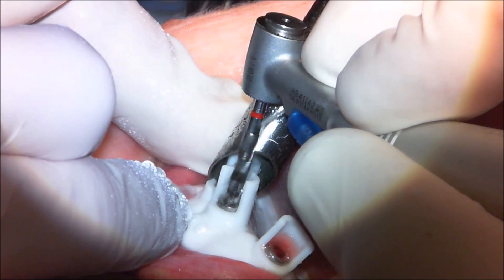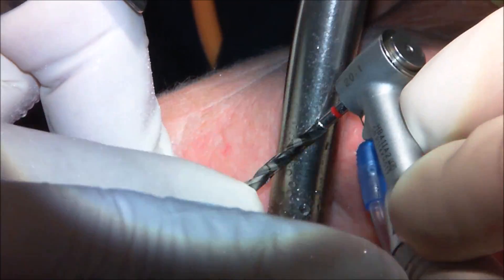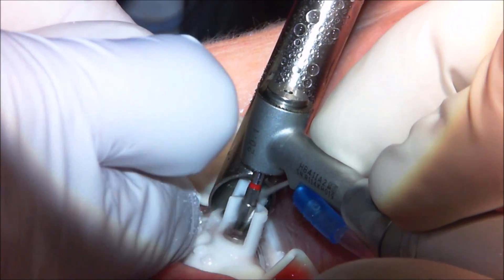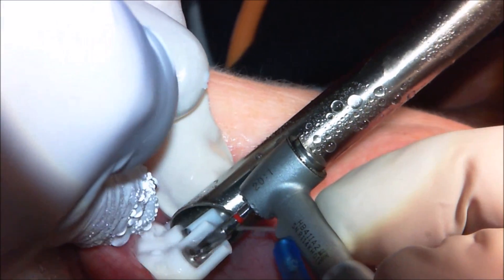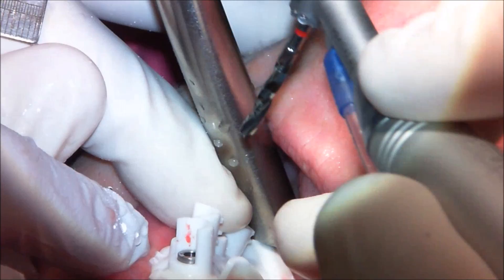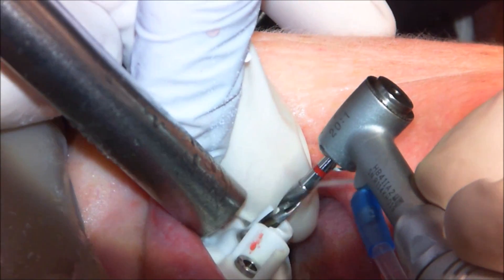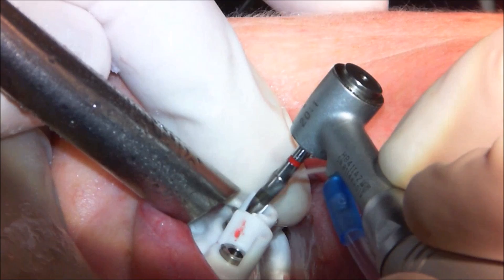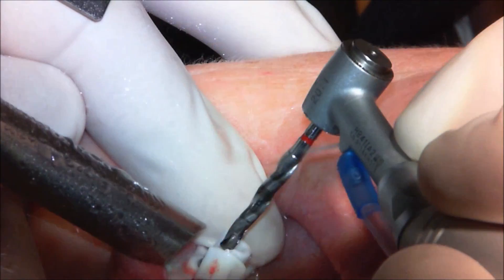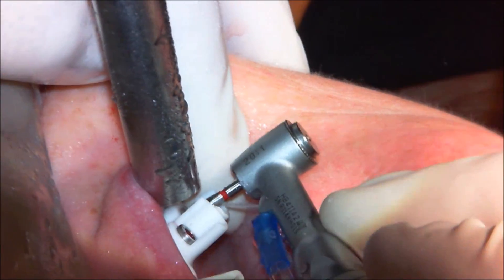Once again, I penetrate through the soft tissue initially, then bring the drill out and clear all that soft tissue from the drill flutes before driving deeper into the bone. We use our pumping motion, keep it well irrigated, and sink the handpiece until it bottoms out on the drill guide. Moving to our next osteotomy and bottoming out there as well.